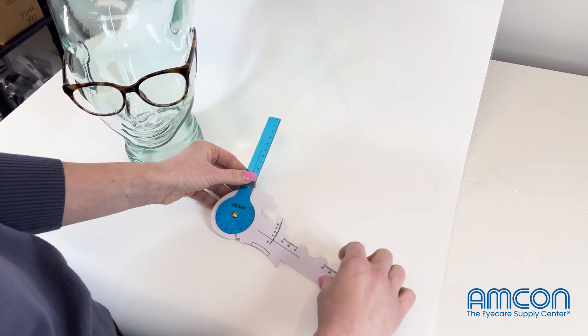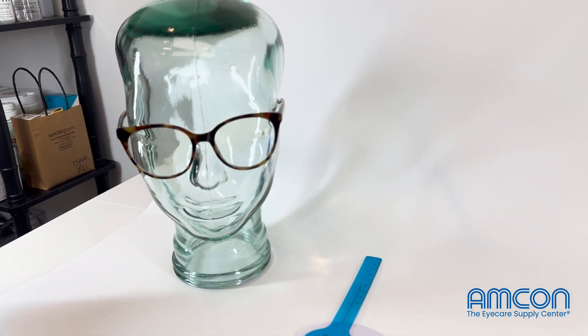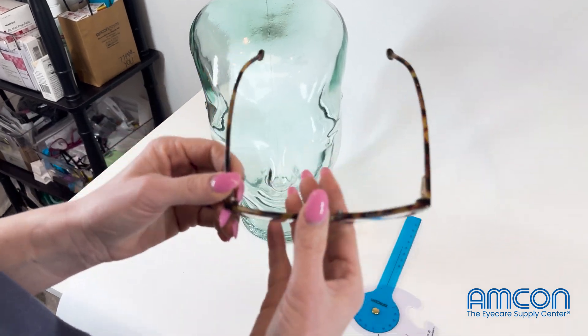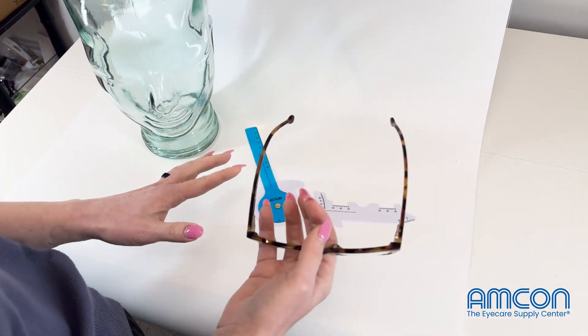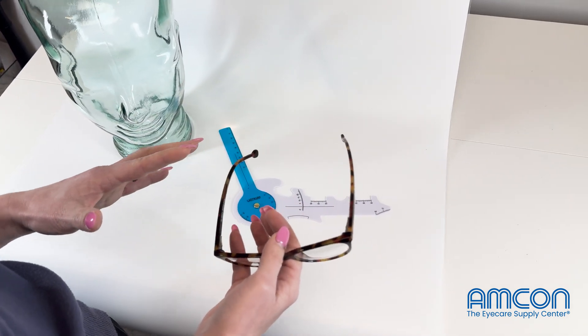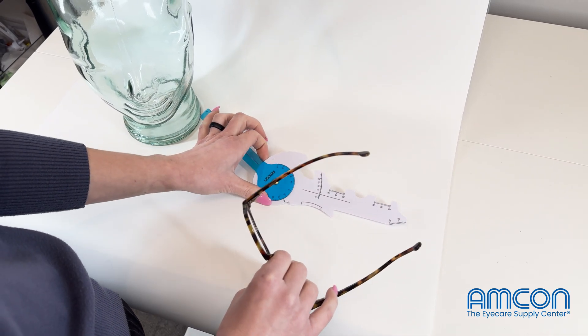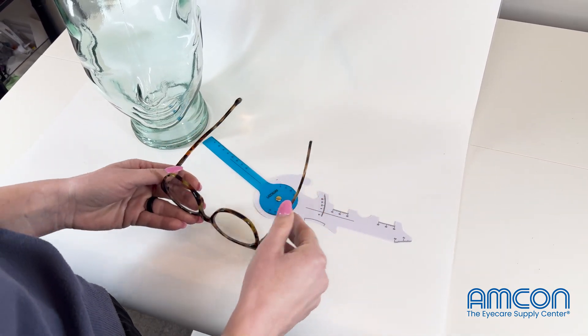Here we have Gerald, our model, wearing some glasses. The way you would use this is to take your patient's glasses, because especially with digital lenses, every patient is going to have different measurements in terms of how glasses sit on their face, and this is your ruler to take all of those measurements with.